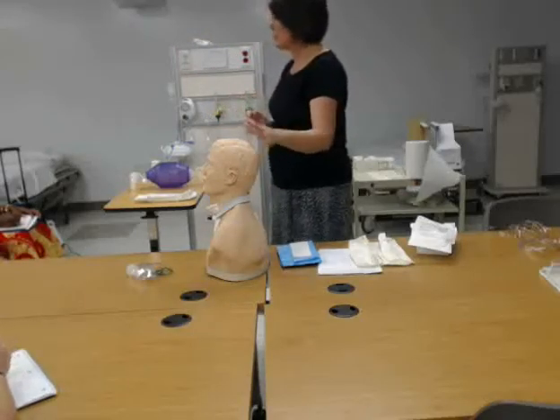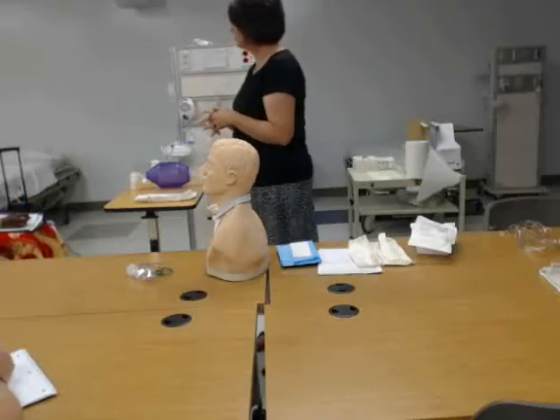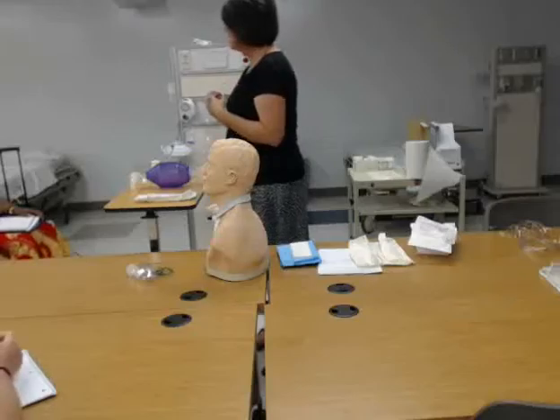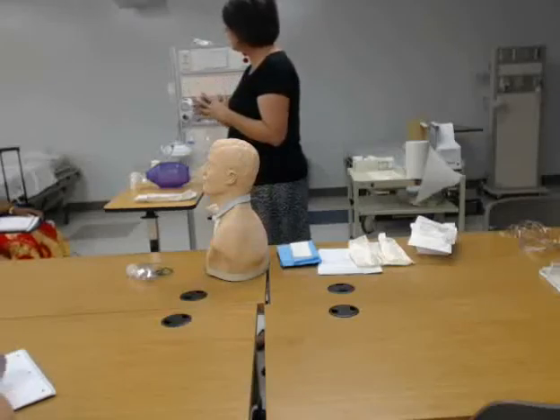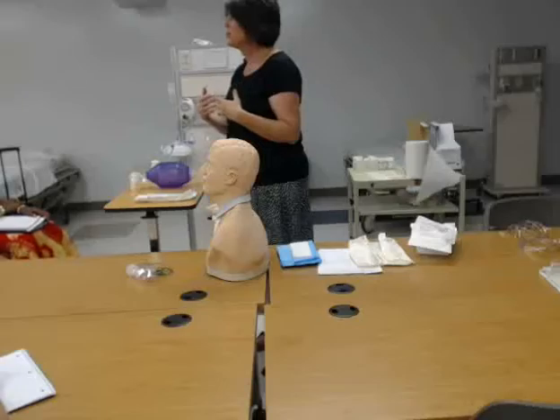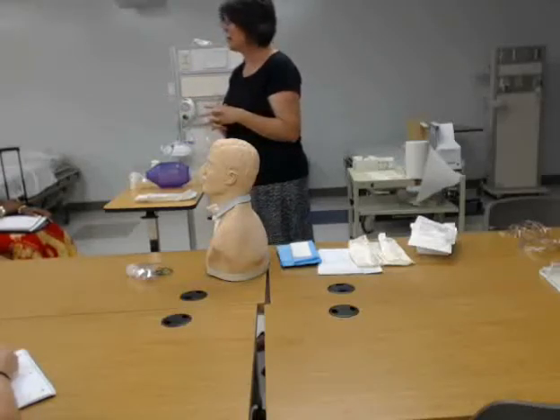Why would we suction a patient? What would be a reason to suction a patient with a tracheostomy? Maybe there's a plug and we can see that they're not getting air in. Maybe there's excessive secretions, or maybe there are secretions and they're not able to cough them out on their own. Those would be why we would suction.